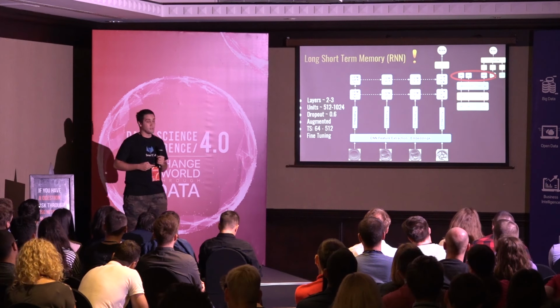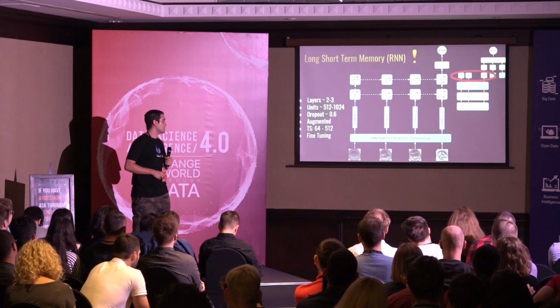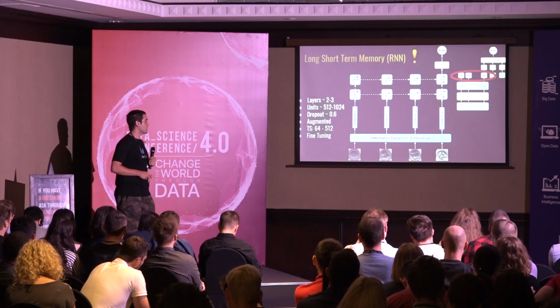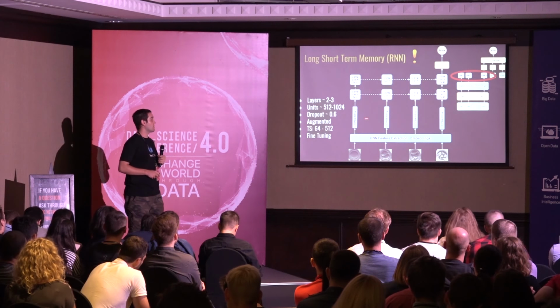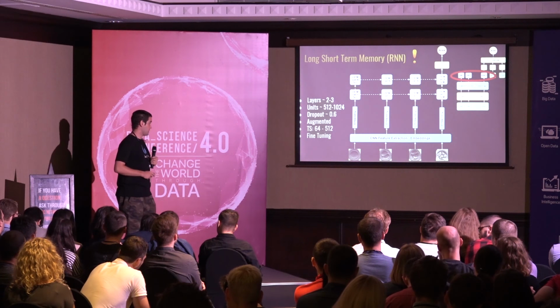So this is basically what I said earlier. There are some pre-processed embryos from UNETs. Frame 1 goes to the feature extraction part. Then after it gets its feature vector embeddings, it goes to the multi-layered LSTM network.